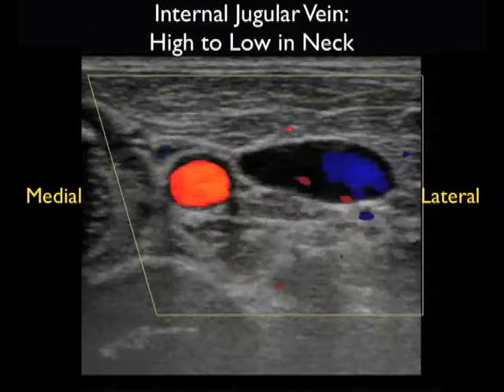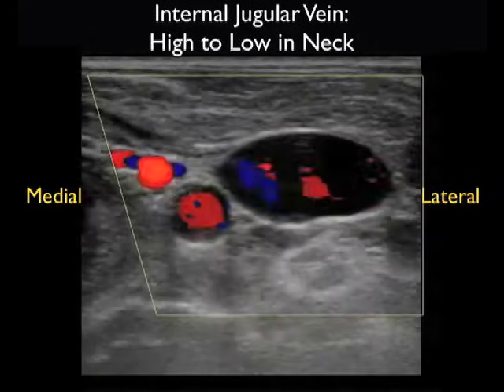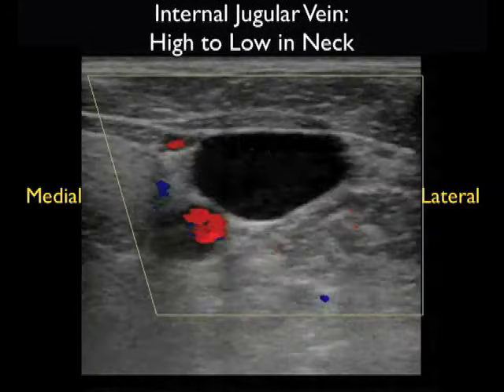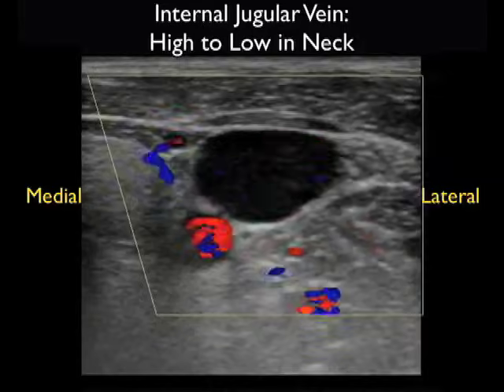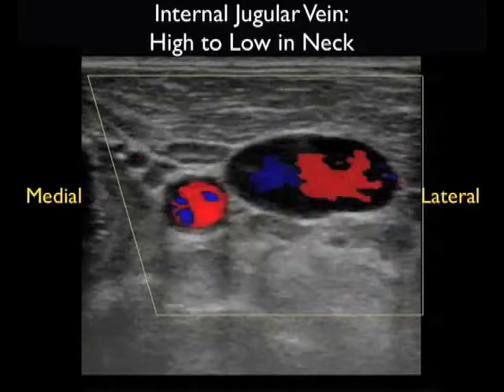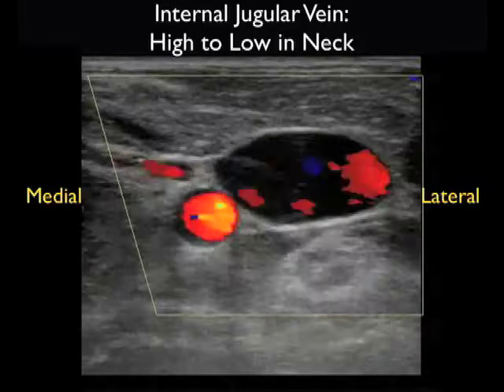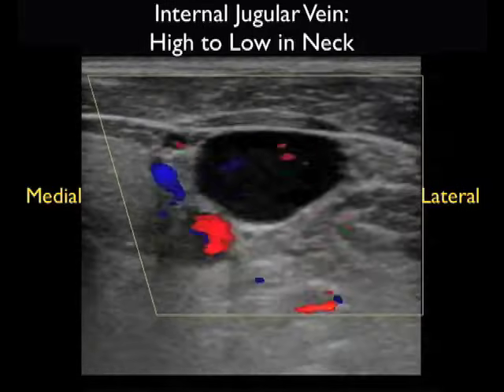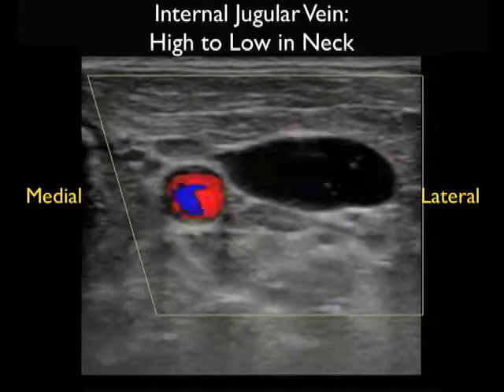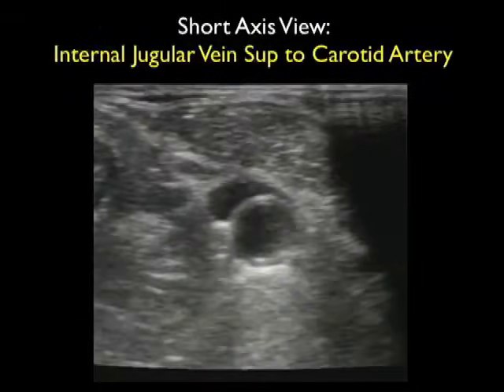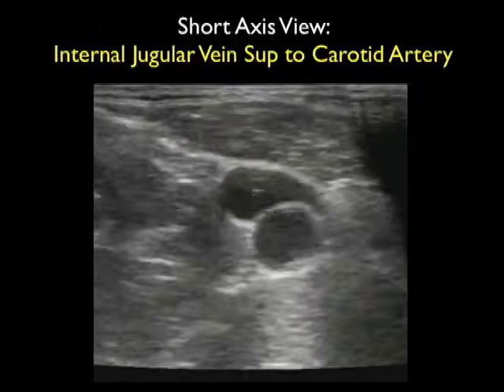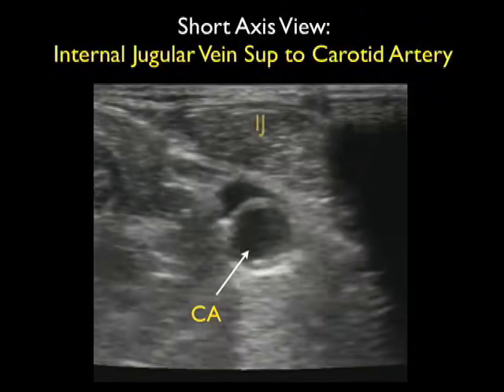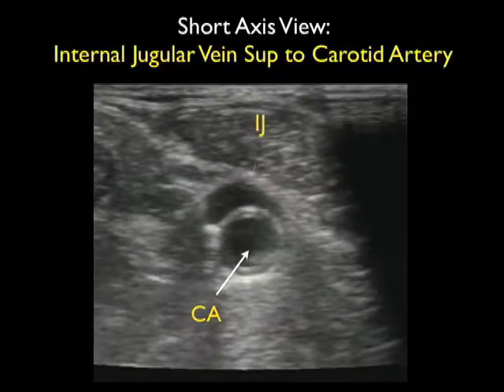Even within the same patient, we're running the probe from a position high within the neck — in which the internal jugular vein is seen more laterally — to a position more inferiorly, in which the internal jugular vein comes to rest more medially on top of the carotid artery. Here's a different patient in which the internal jugular vein is seen smack on top of the carotid artery.